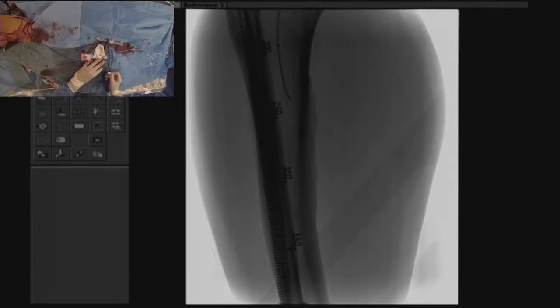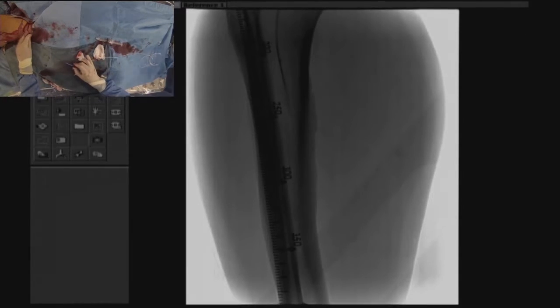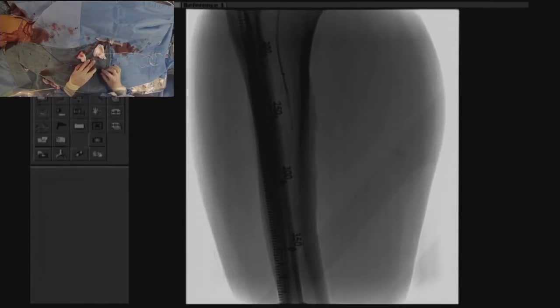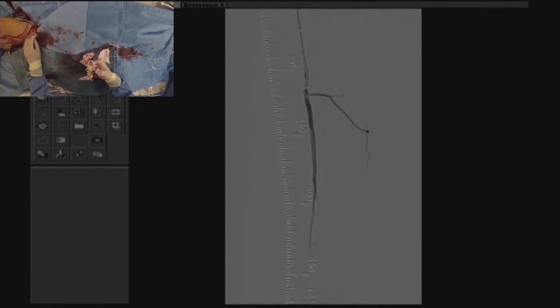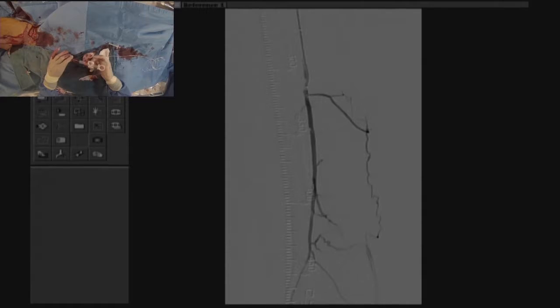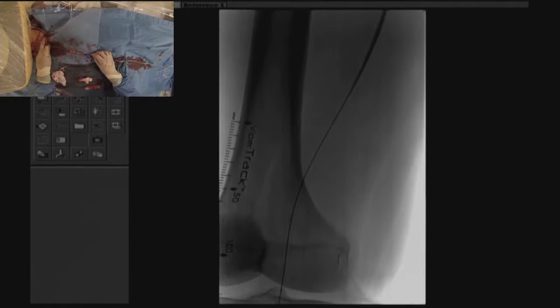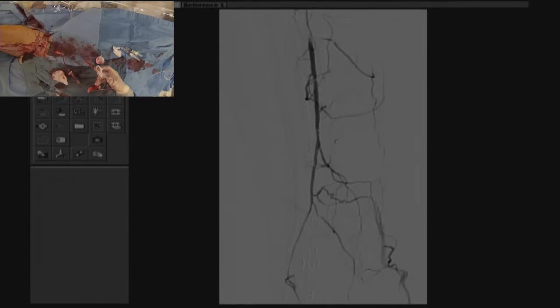You can see with the selective angiography there is no flow in the posterior tibial artery. The next image shows us navigating under fluoroscopic guidance the occlusion within the mid-peroneal artery to the distal peroneal artery. We made the decision to treat the mid-to-distal peroneal artery to relieve the 100% occlusion that we see here. The next step shows us taking a 7 French Destination Pinnacle 45 cm sheath in antegrade fashion, and we have decided to deploy an embolic protection system.